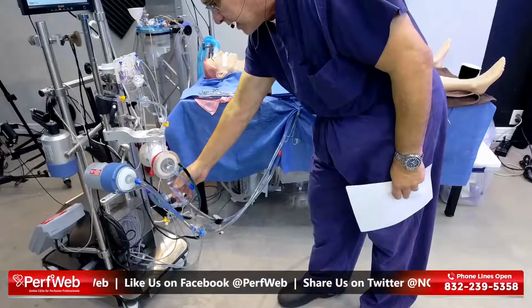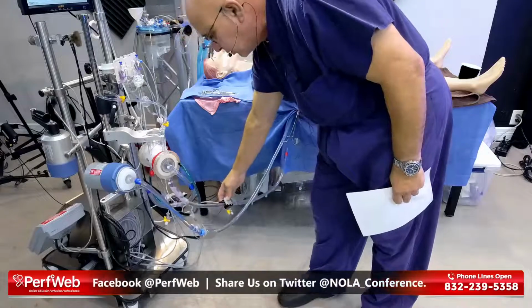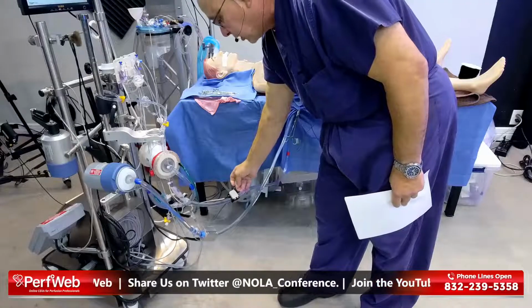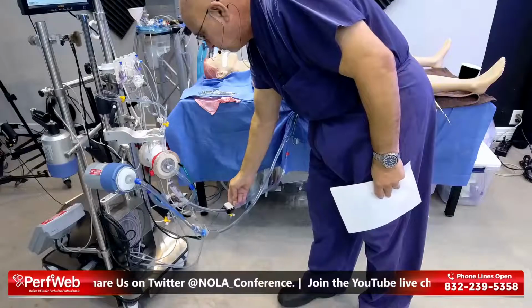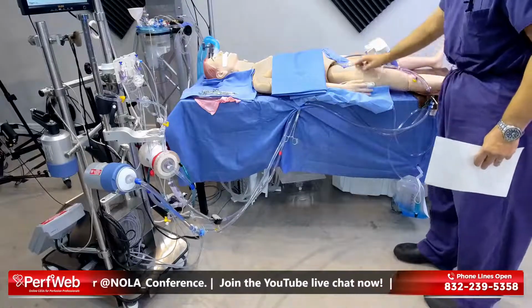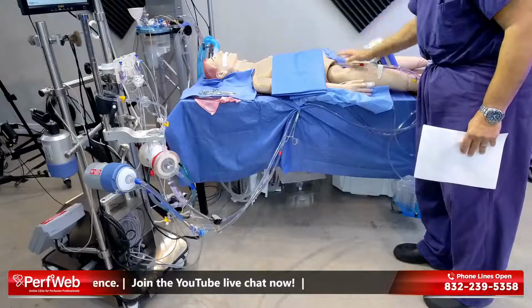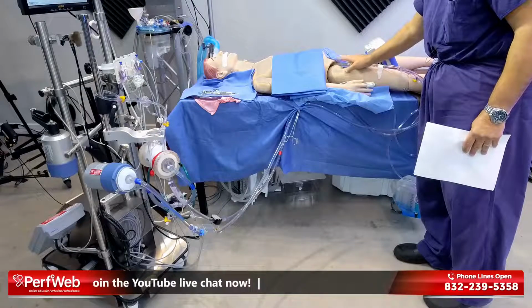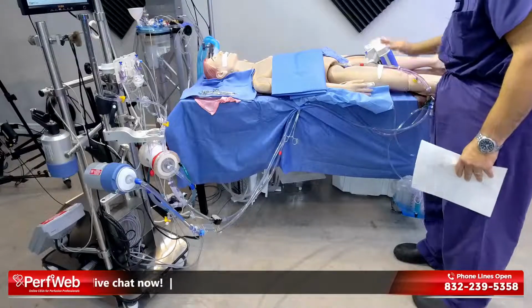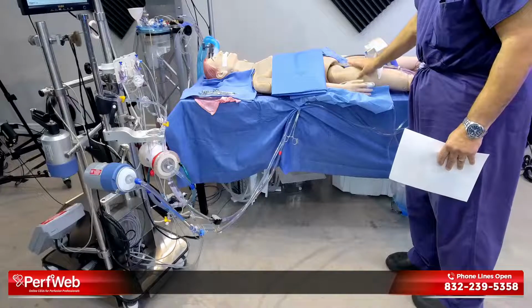It now exits the oxygenator here as arterialized blood, goes through our flow meter, through our return pressure transducer, and then returns back to the patient in the femoral artery that's on the same side. Again, the Impella is on this side, and both the access and the return are on this side. The patient has a Foley in, but no other issues. So this is the basic circuit.